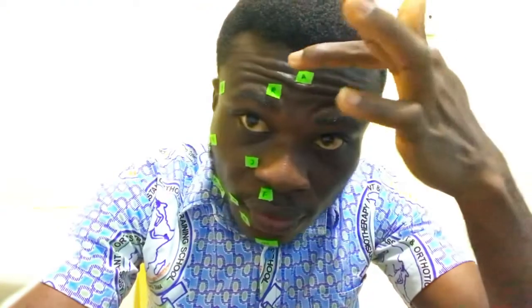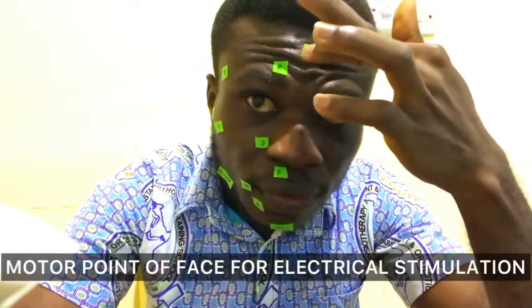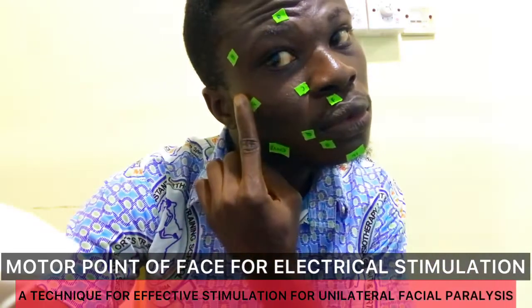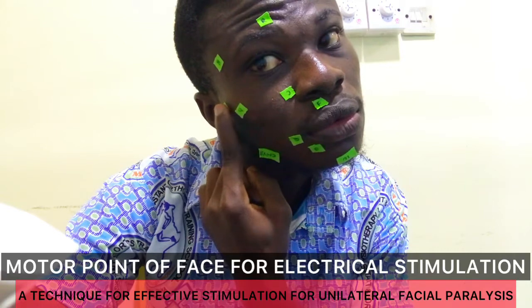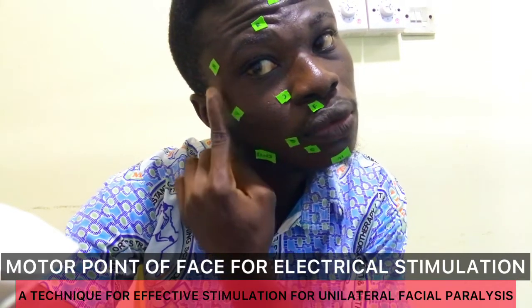One of the protocols for the management of Bell's or facial palsy is electrical stimulation. It is very simple to use TENS units and other equally important modalities for this stimulation. This protocol can help retrain the function of the muscles which are weak due to Bell's palsy or facial palsy. It is possible to revive the weak facial nerve via the stimulation.